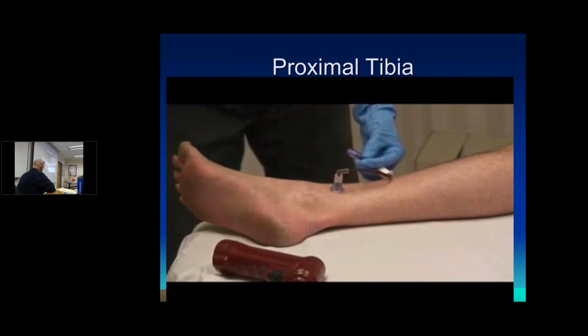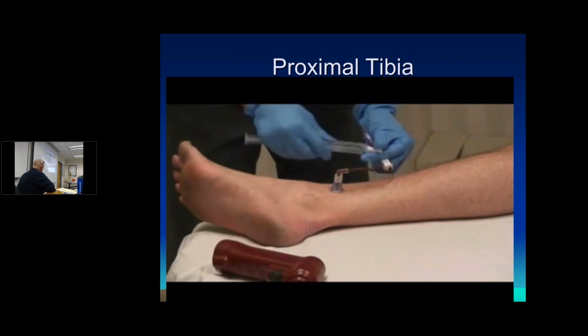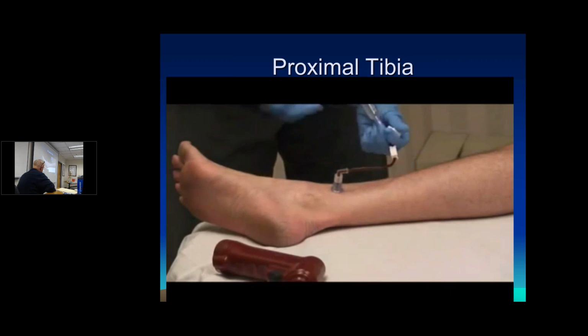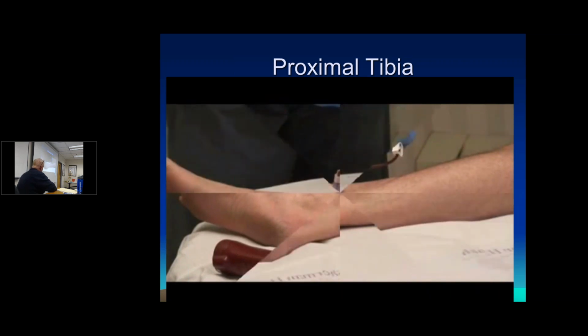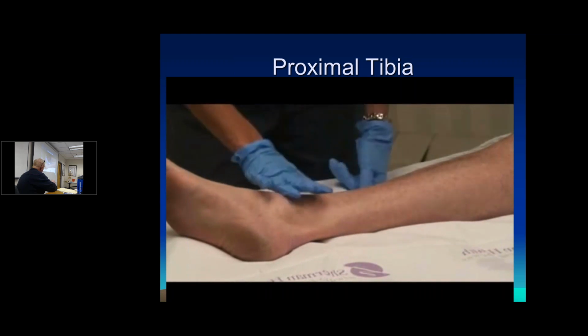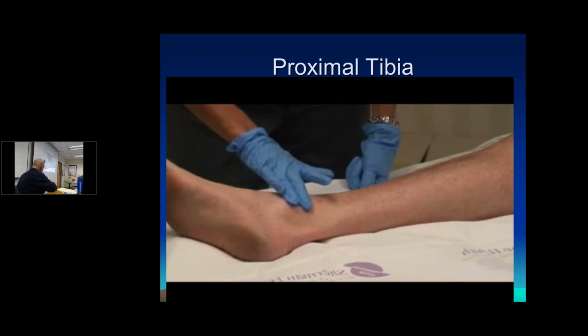And then I would take my 10 cc sterile flush, unclamp my tubing, and that's where I would do my flush. So the other connection you can have is that three-way stopcock that I talked about, and that would go right along with your extension tubing. That way you can run fluids or drugs off of one port.